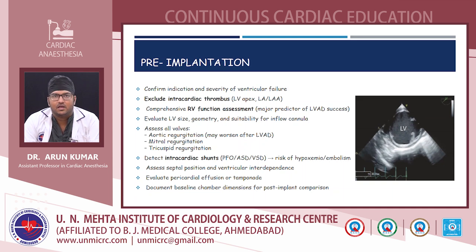These areas must be thoroughly evaluated, and there should also be a comprehensive RV function assessment. RV function is a major predictor of LVAD success, and we should evaluate the LV size, geometry, and also the suitability of the inflow cannula.